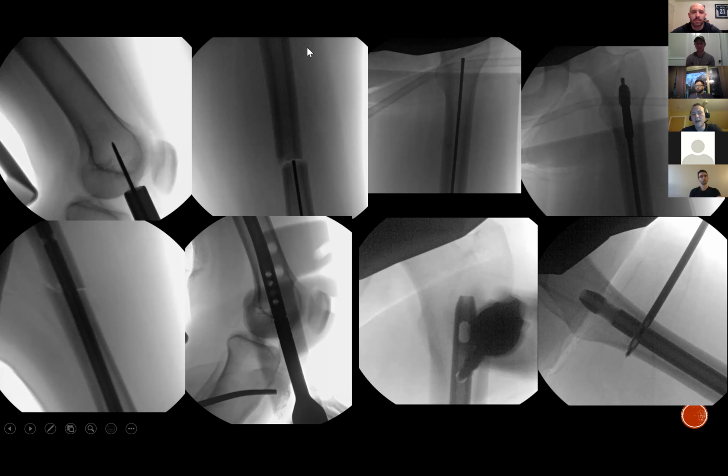One important technique to that, especially for our incoming interns and for our current interns, is that if you are experiencing chatter, you do not stop the reamer, ever. If you stop a reamer at the point where you are hearing and feeling chatter, that means that that reamer head is tightly engaged here. And if you stop, it may embed itself. And then when you start to turn it again, it may bind.